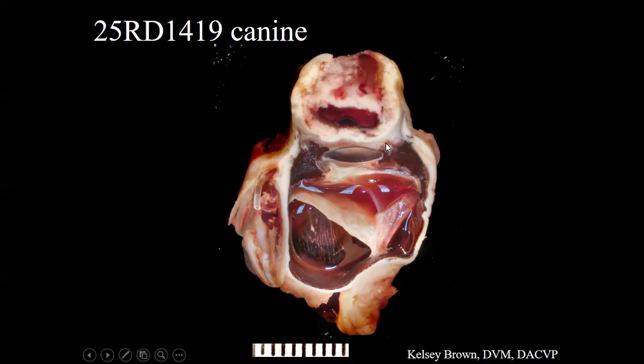So we have that. Other things that we can see, indeed, the cornea is protruding anteriorly. It is extremely thickened, and there are these kind of cavitated areas of necrosis and hemorrhage. This would be a cornea that you couldn't trust not to treat. Right. I would not. I feel good about that.